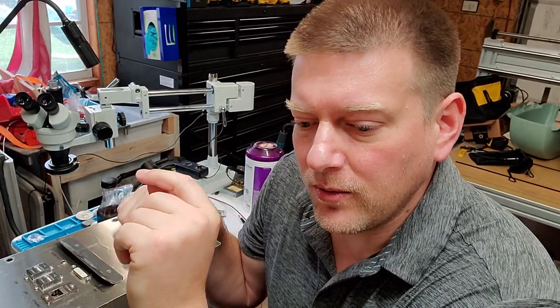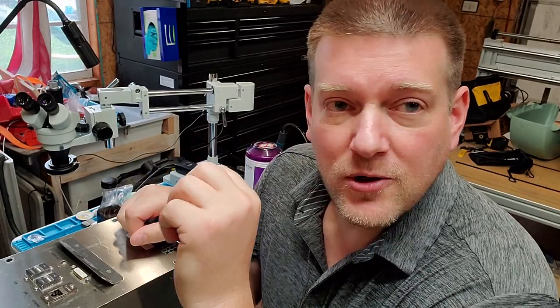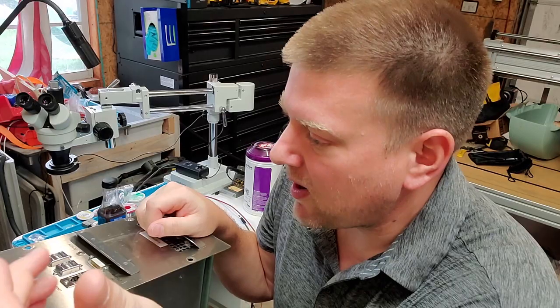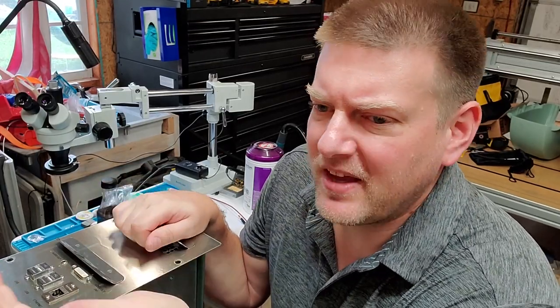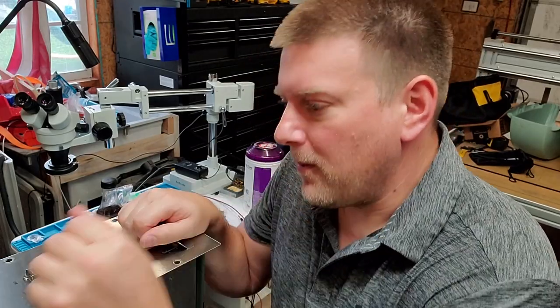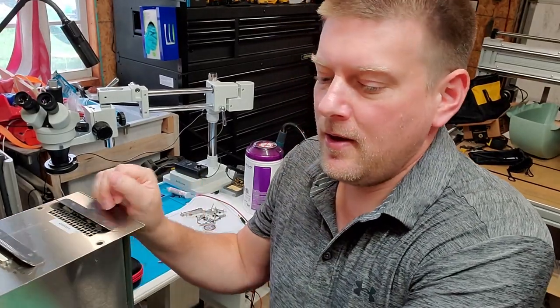Often on old motherboards, there's going to be power filtering capacitors, usually around the CPU socket, and those capacitors will tend to bubble up with age. I guess that this guy here is probably reasonably old, based on the type of ports it's got, you know, DVI ports and stuff. That's going to be an older type of motherboard and/or video card. So, guys, let's go ahead and take a look on the inside of this guy.